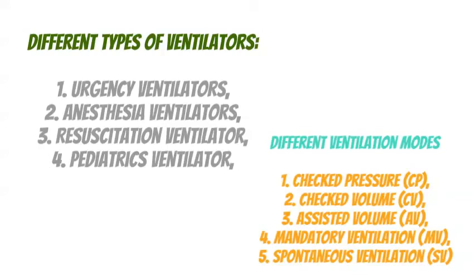In assisted volume mode, the patient initiates each breath. The ventilator automatically adjusts the level of assistance by adjusting the volume of delivered gas. The objective of this mode is to supply ventilation where each respiration is initiated by the patient, allow assisted ventilation in case of apnea, and supply variable assistance according to the patient's need in each respiration. The application of this mode is to provide support to patients with an insufficient capacity to breathe.